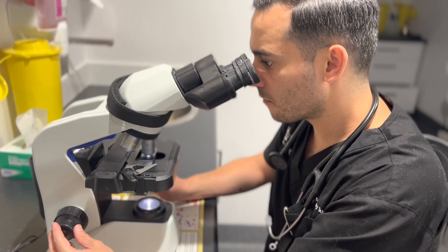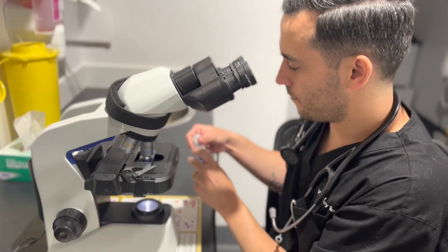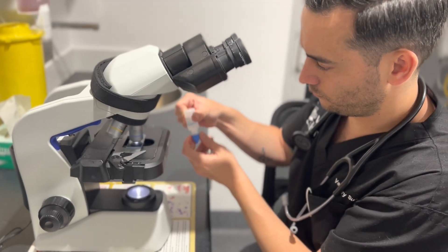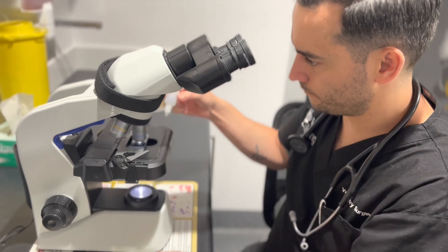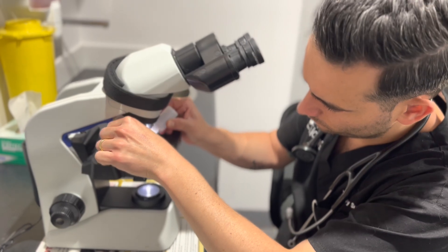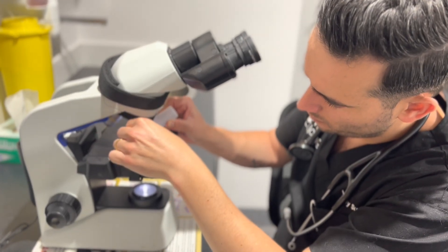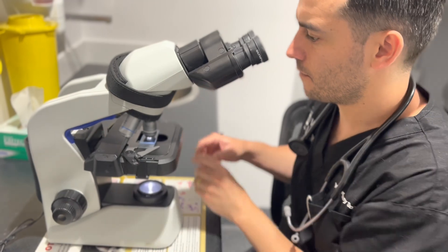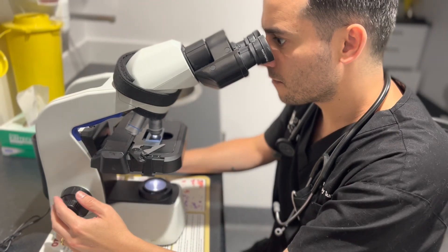We may also recommend further testing if we suspect that the organism may be resistant to treatment, or if we suspect your pet may have a cancerous growth. A veterinarian is required to perform this test as it requires interpretation at a microscopic level.